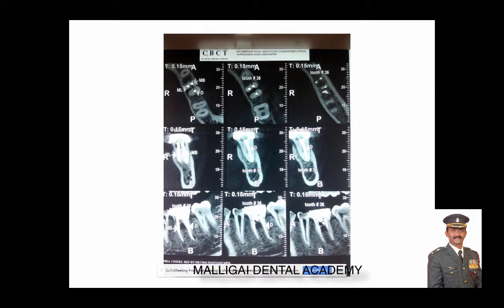I recommend, my bullet point, I recommend a CBCT endoscan for every repeat root canal case so that you know what canals have been missed, what could be the probable reason for the failing root canal. I would also recommend an endoscan for difficult or inconclusive fresh cases that come to your clinic for root canal.